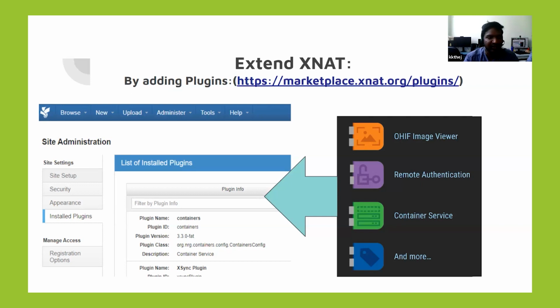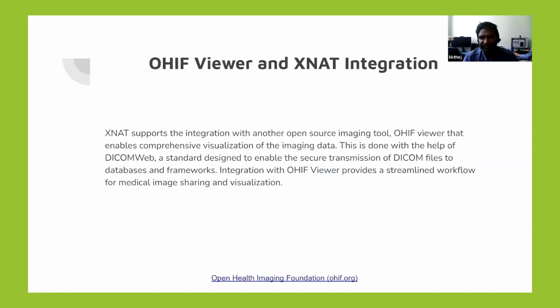You make the plugins, and you can customize even the user interface of the XNAT. You can add extra pages if you really want to show extra information from the subjects or whatever you want to modify in your XNAT instance, and it will be site wide. Any user will have these new pages that you add.